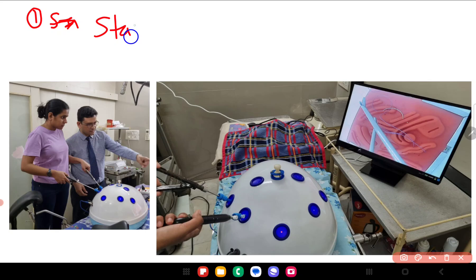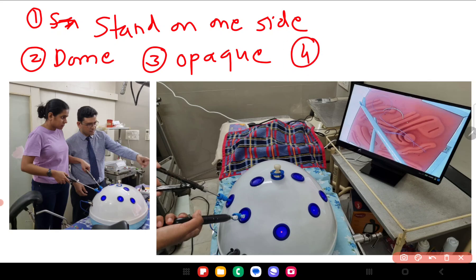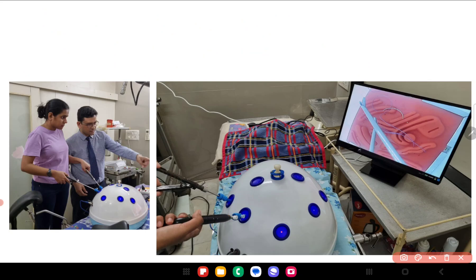To recap: first, stand on one side; second, the pelvic trainer has to be dome shaped; third, it has to be opaque; and fourth, if you are doing ipsilateral surgery the port placement has to be at different levels — not in the same line. If the ports are in the same line, it will not simulate real ipsilateral surgery correctly.